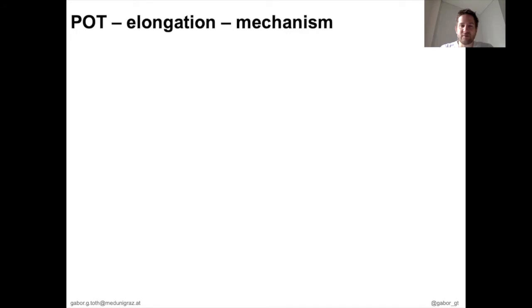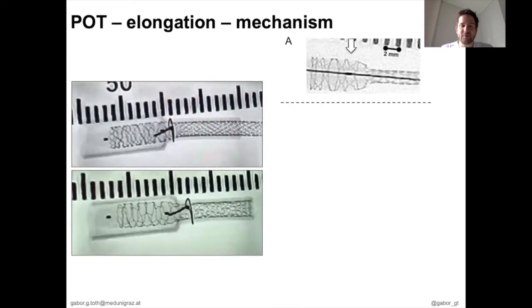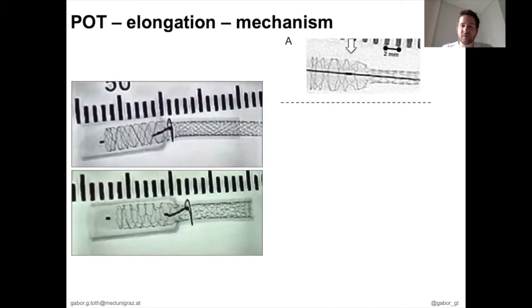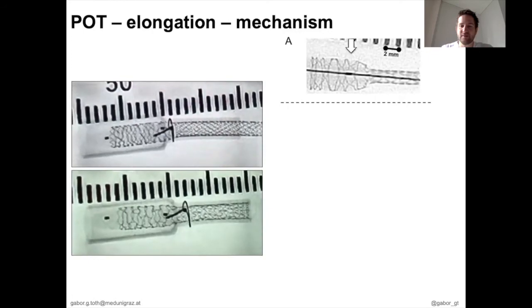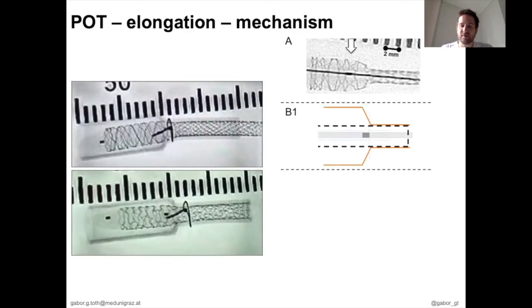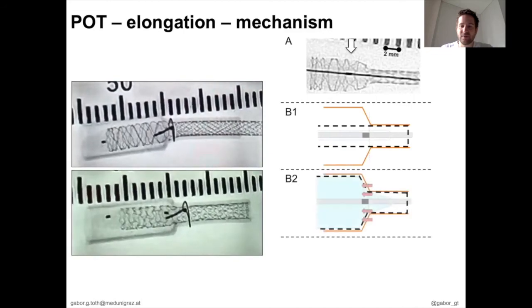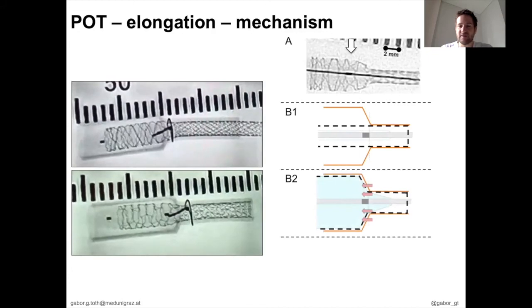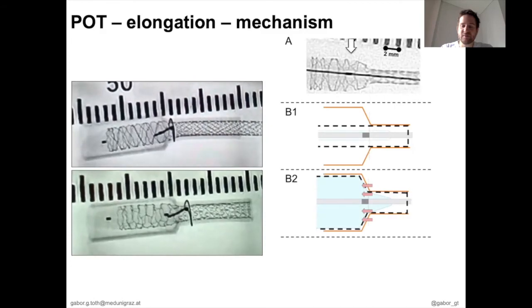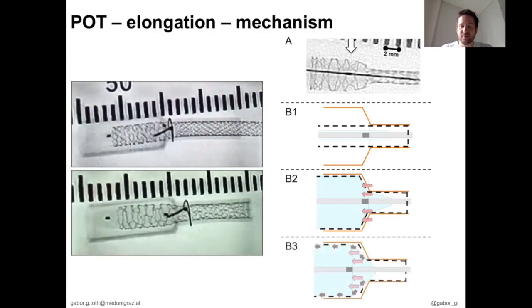Where does this elongation come from? Our observations suggest that this elongation comes partially from the POT balloon itself. Namely, there is a marked conical tip distal to the distal marker of the balloon, meaning that the proper carinal position of the marker ends with overexpansion within the daughter branch ostium. And in case of a certain resistance here, a calcified lesion or strongly fibrotic lesion, this results in proximal slipping of the balloon, a kind of melon seed effect, which stretches the stent towards proximal.